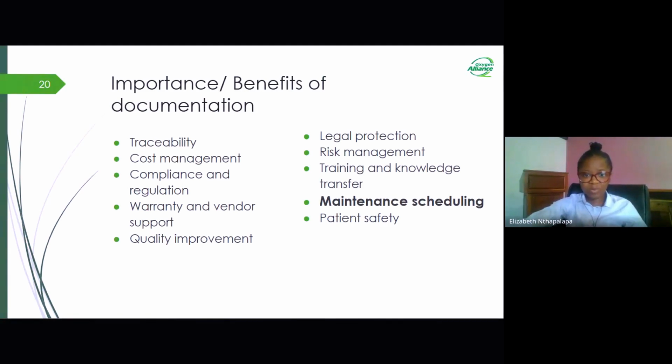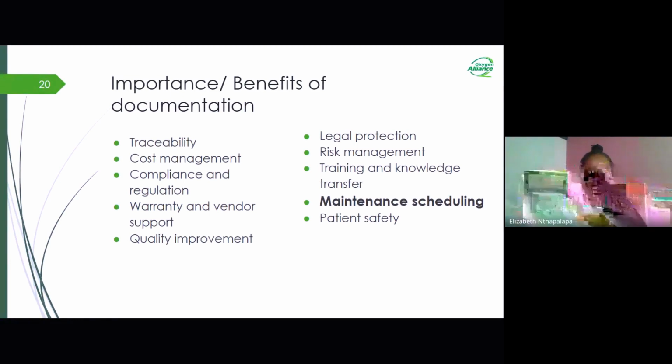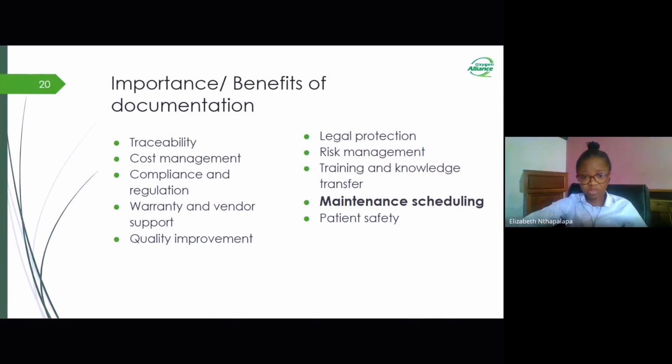And lastly, we have patient safety as a benefit that we gain from proper documentation. Accurate documentation helps to ensure that the medical equipment functions properly. So this reduces the likelihood of errors or equipment failures that could harm any patient. So in as much as we try to make sure that everything we're doing in the hospital is safe and sound, documentation also plays a very big role in providing this safety.